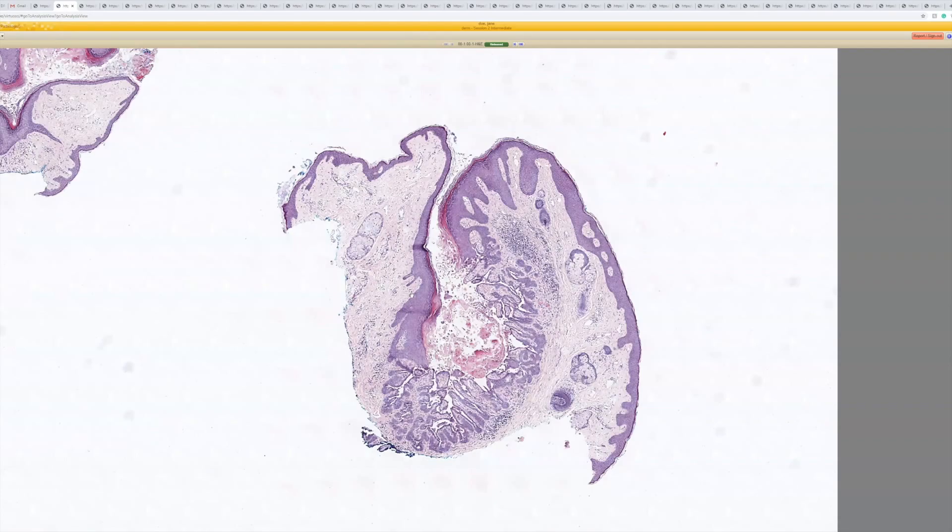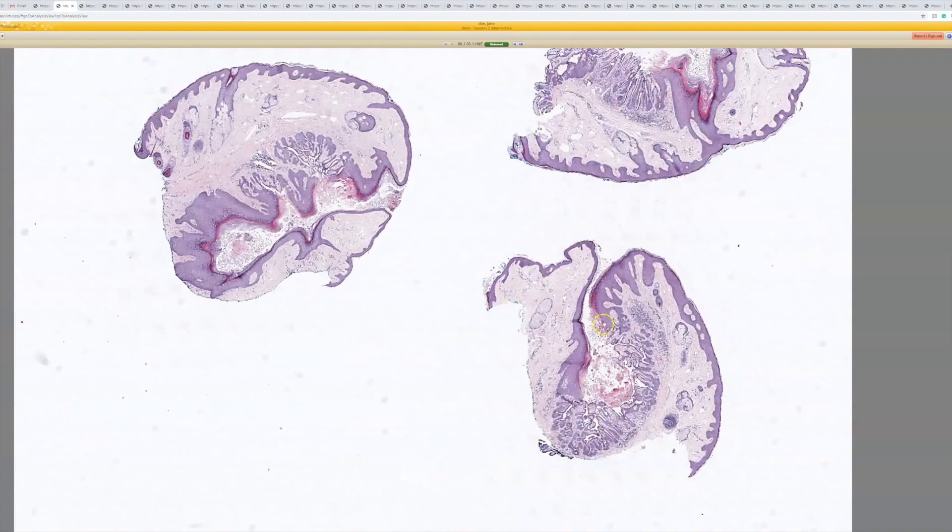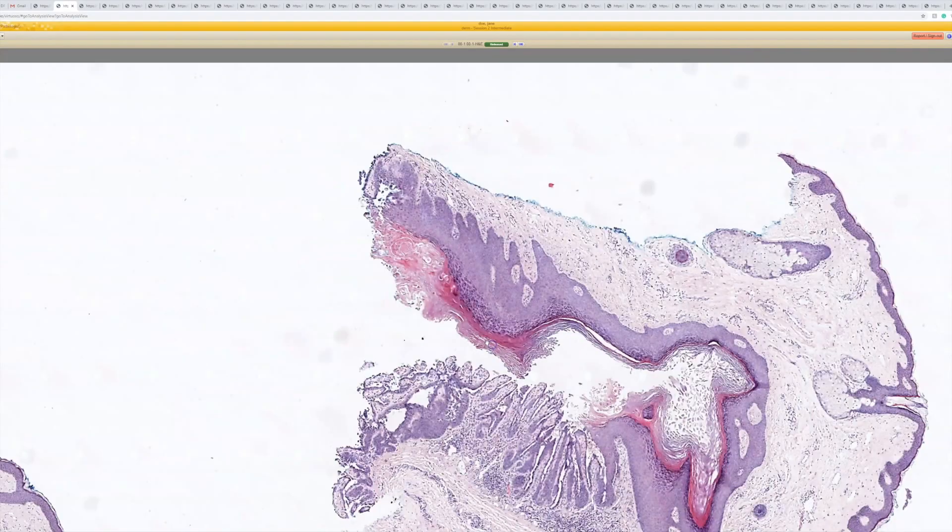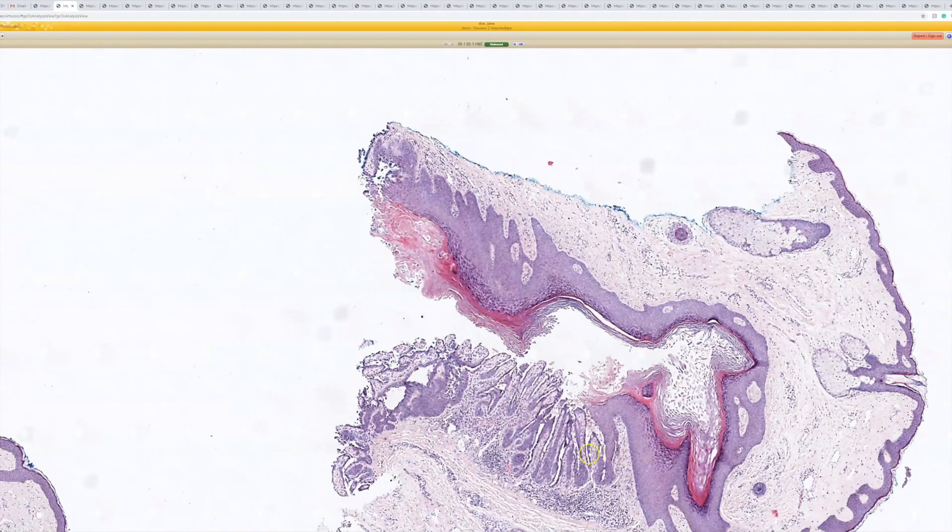But if you cut anywhere to the side of that, you're going to just see a cyst. So this lesion sometimes looks just like a cyst rather than showing that nice connection to the surface. So if you only learn this pattern, you're going to miss ones that are going to sometimes look like this and be cystic and not have a good connection, okay? So that's case one, warty dyskeratoma.